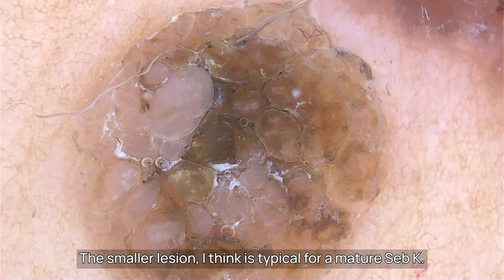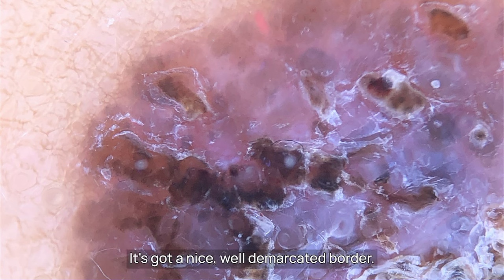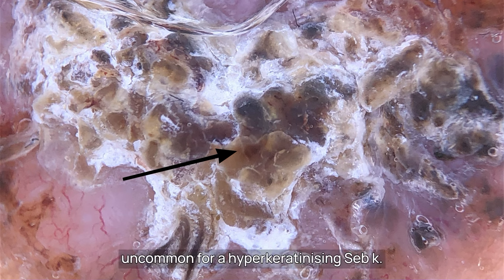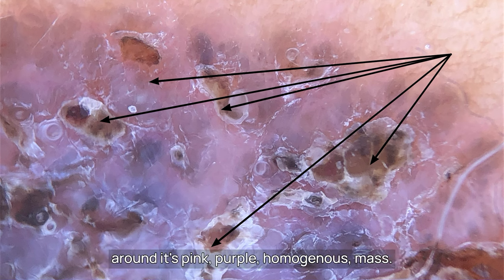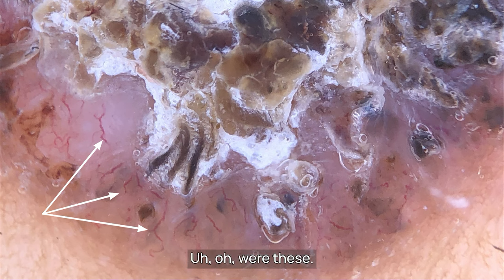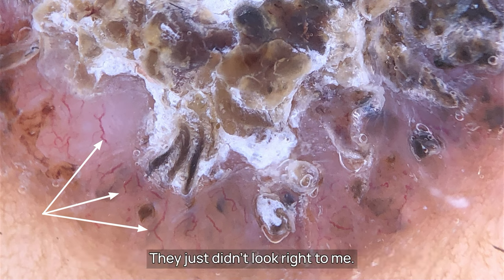The smaller lesion I think is typical for a mature Seb K — fissures and that yellow-brown colour. The large lesion has a nice well-demarcated border and a central keratin mass, not uncommon for a hyperkeratinising Seb K. There are even some comedone-like structures around its pink-purple homogeneous mass. What got me thinking 'uh oh' were these vessels. Are these hairpin vessels or linear serpentine vessels? They just didn't look right to me.